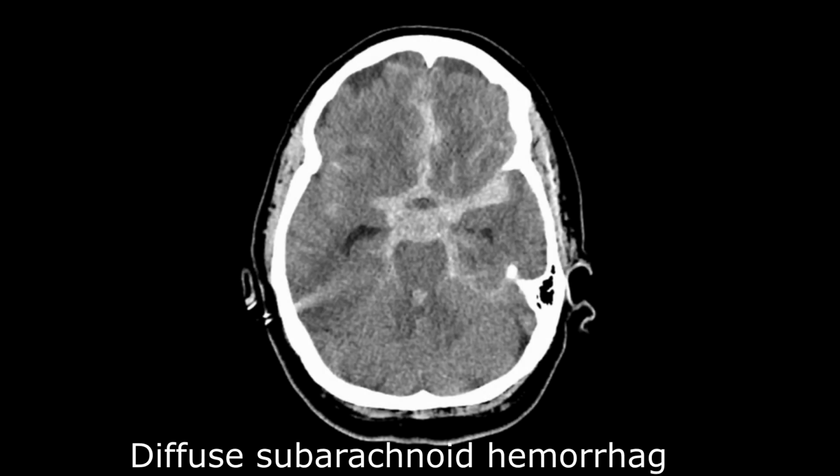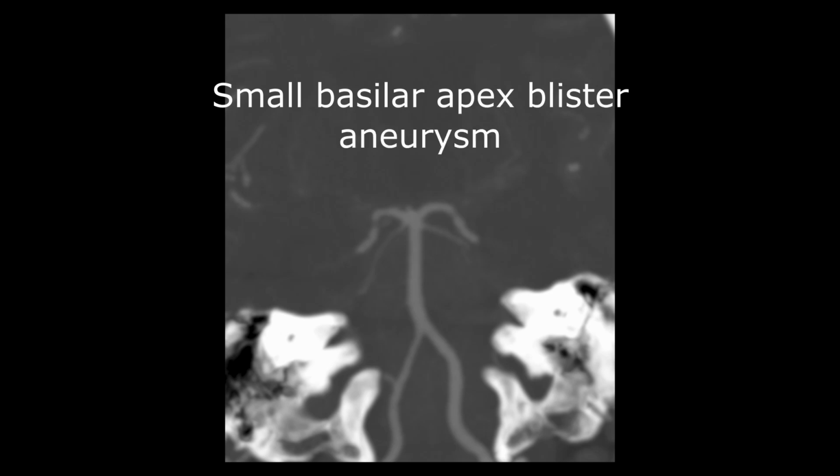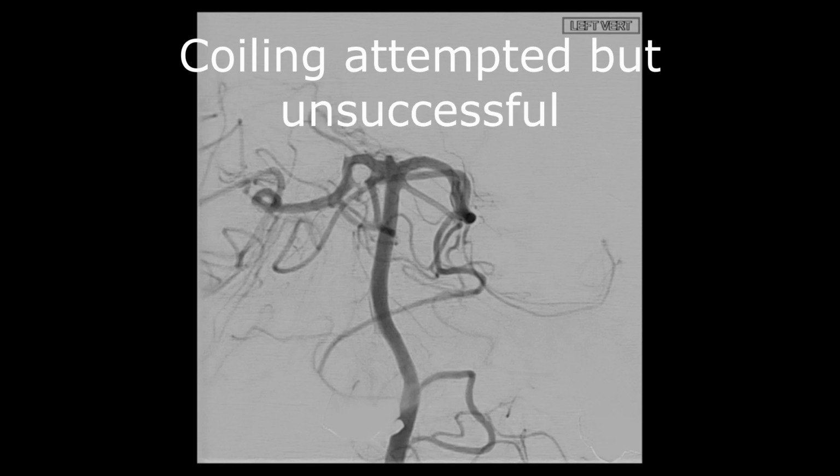This is a case of a ruptured basilar apex aneurysm treated with surgical clipping. You can see the small aneurysm here. It was blister-like. Coiling was attempted but unsuccessful, thus she was taken for surgery.